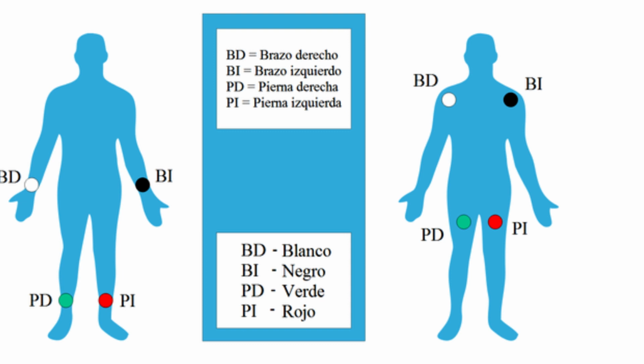Before we move to the ECG, I want to discuss the ECG machine. The ECG machine has 10 electrodes. All of them are attached to our body. 4 electrodes are attached either to the ankles and the wrists or to the hip and shoulder joints. It does not really matter. Now, before you place the electrodes, keep in mind that the electrode-skin contact should be clean. Sometimes even shaving may be necessary to remove excess hair. Plus, a conductive substance should be applied there, a gel or a fluid. Both of them are fine.